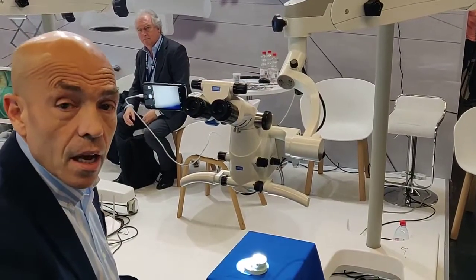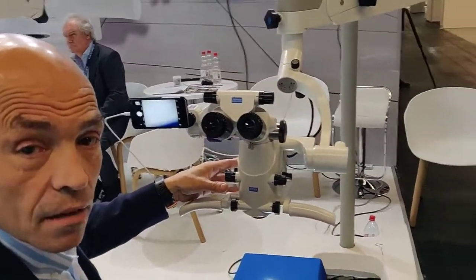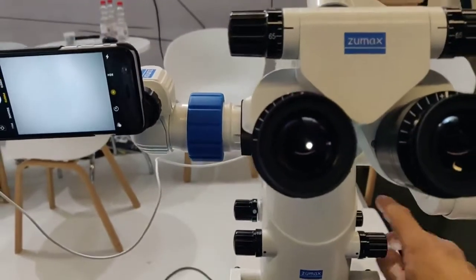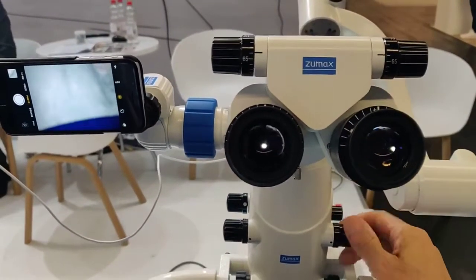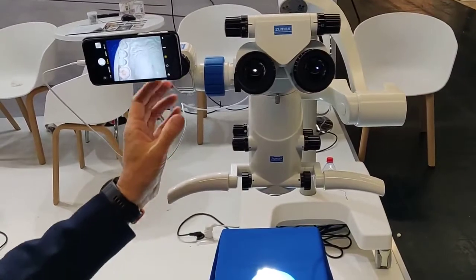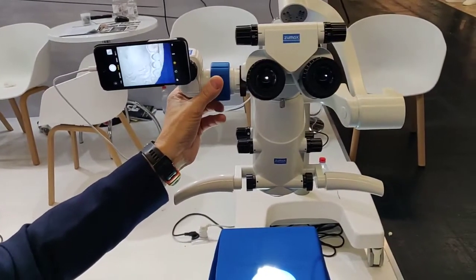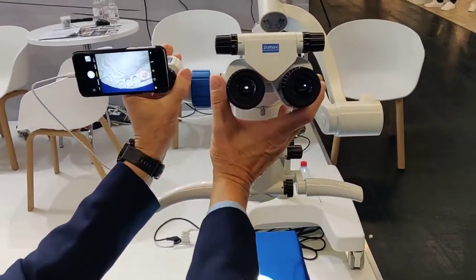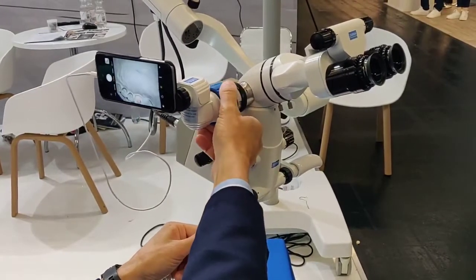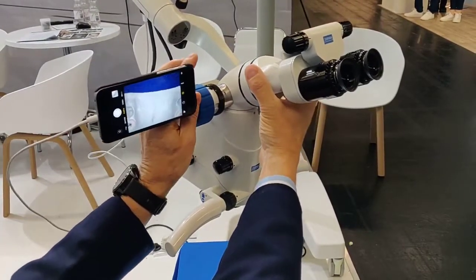You have to adjust your interpupillary distance here. We also have the possibility not only to have integrated video cameras, but also to have an external video communication system, which can be, for example, a telephone like this, or can be a camera or a video camera. In this situation, with the phone, you can rotate the image of what you are watching, which is very useful — especially when you turn this so that the assistant can see exactly what the doctor sees by turning the knob. Very useful also for the assistant when helping the doctor in their work.